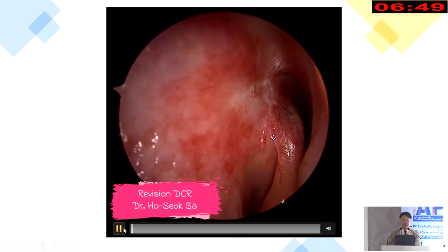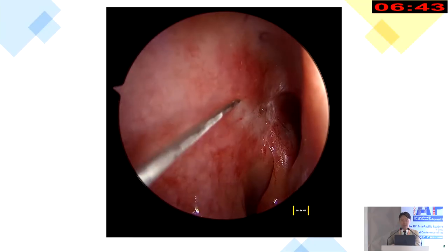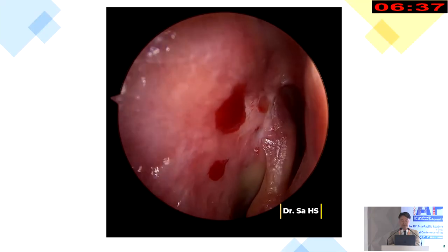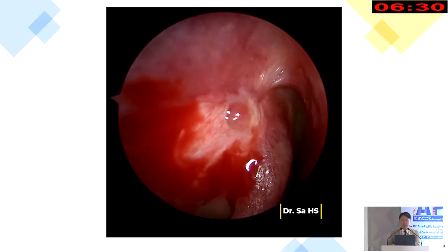During the surgery, you can see a very small ostium at the operculum of the middle turbinate, and after local injection, a lacrimal probe is inserted for lacrimal sac mapping. You can see the level of the common canalicular opening.